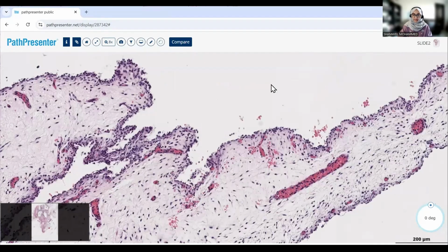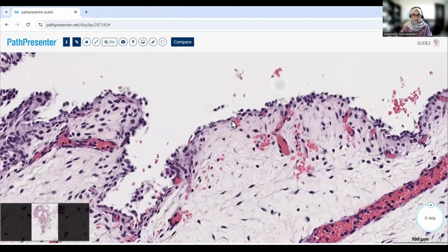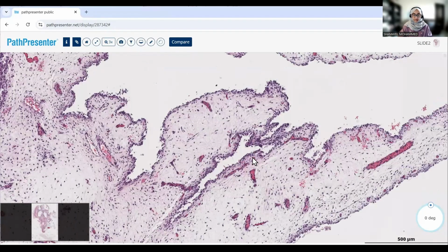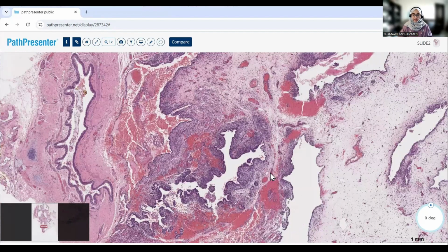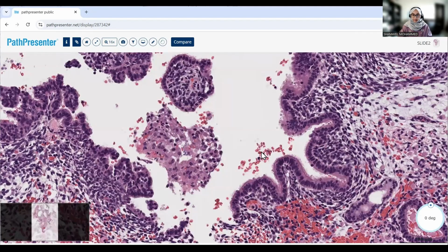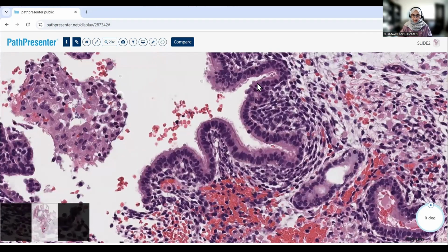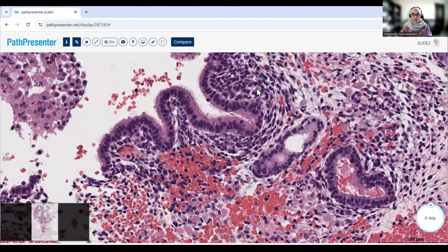So you have the cystic cavity with the edematous wall, and you have the cuboidal to flat epithelium. However, let's look around. It's a big section and we had multiple cysts. This area captures your eye. It's more cellular, more busy. And the cystic cavity, again, the lining with cilia over here. But look at the underlying stroma.